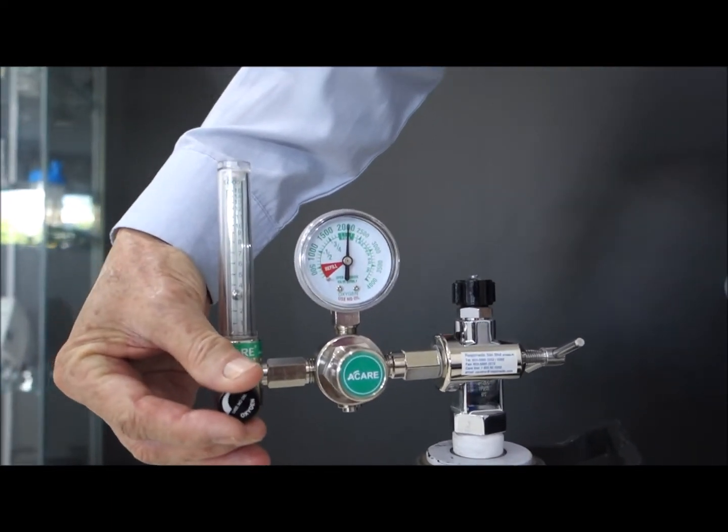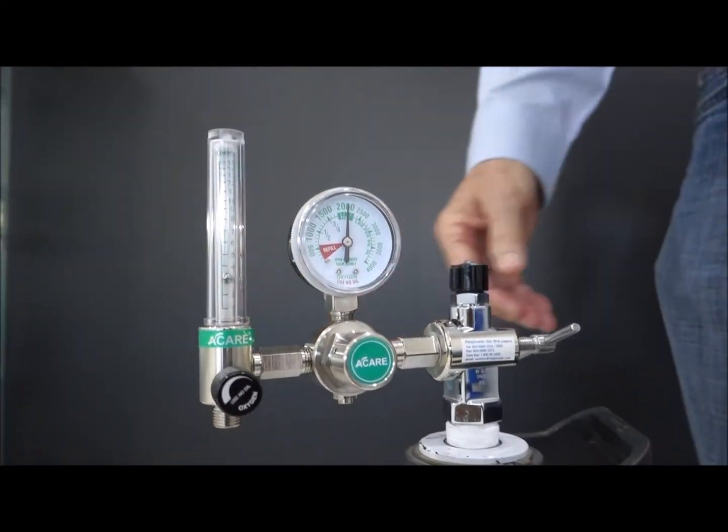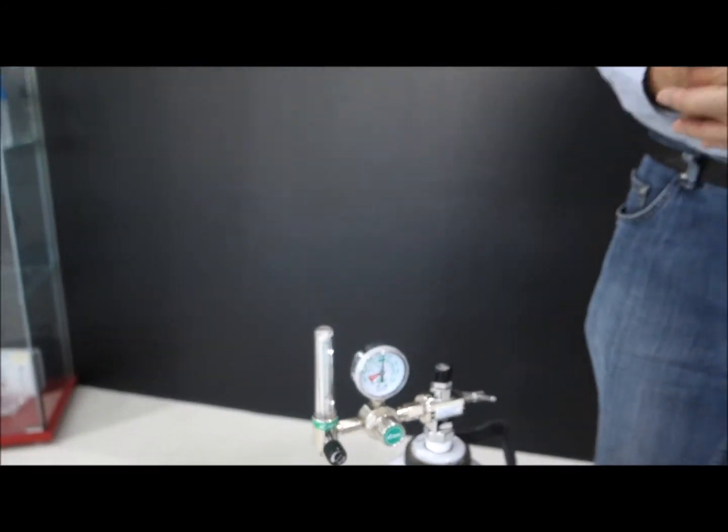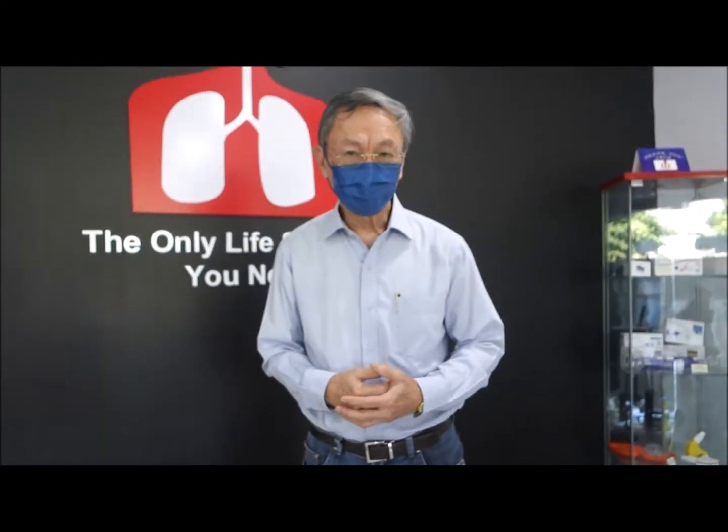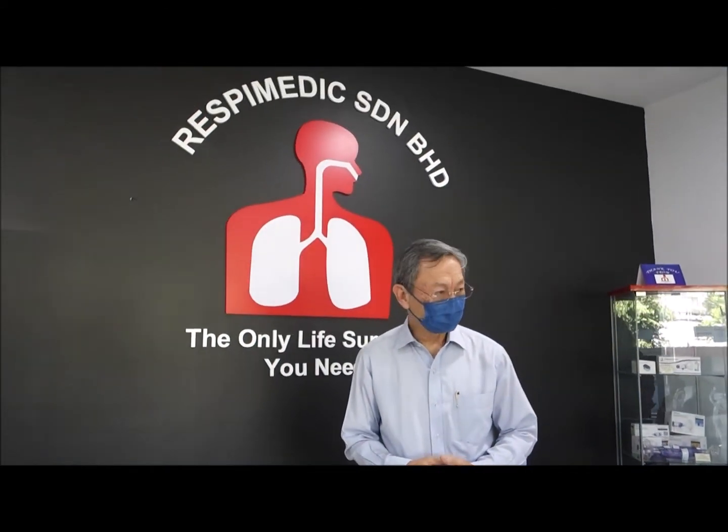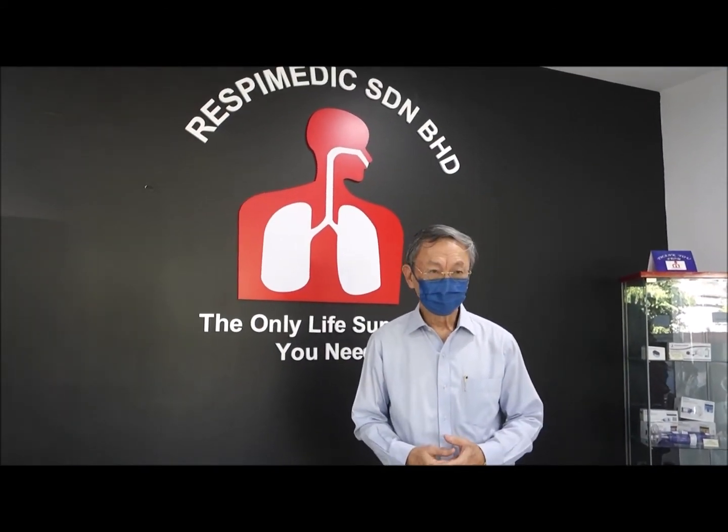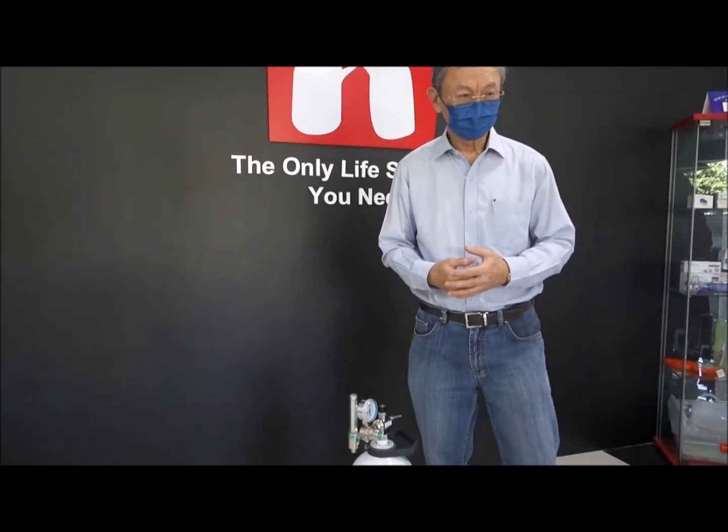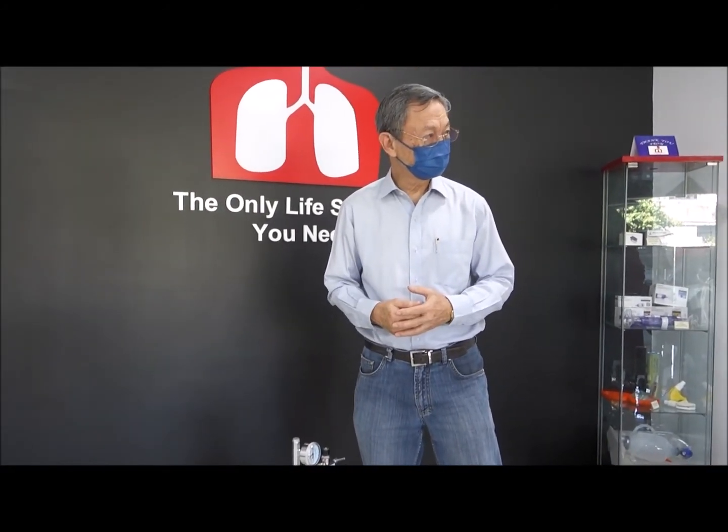So if you set at 2 liters, you should be able to get round about 700 minutes. 700 minutes, roughly gives you 10 hours. 600 minutes another 700 minutes, and then maybe 3 hours. That's about 13 hours.